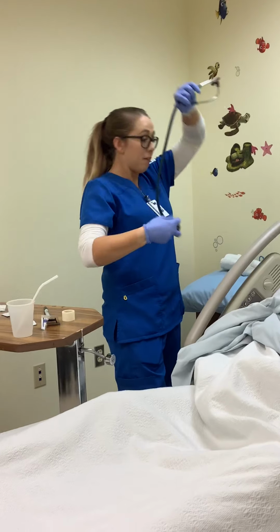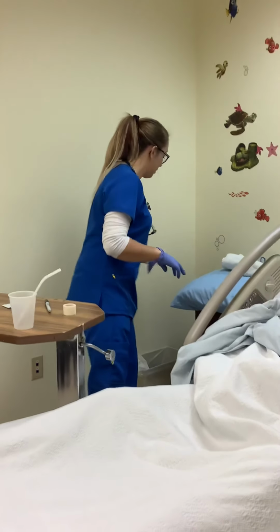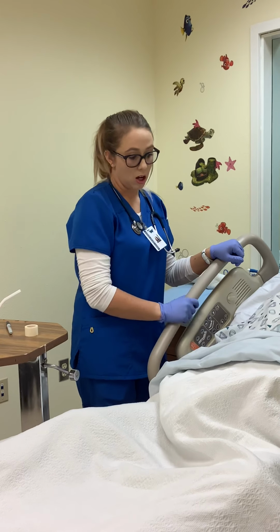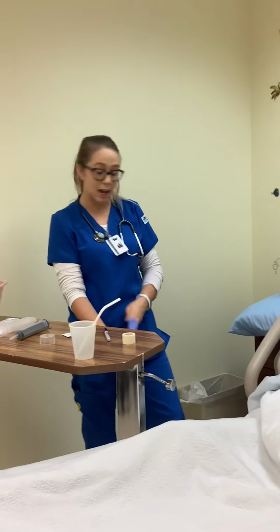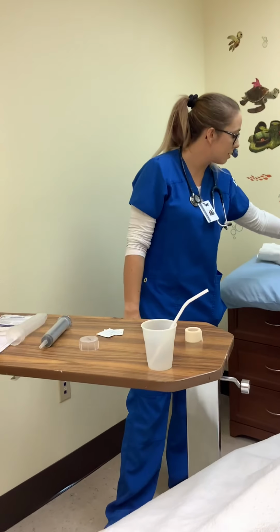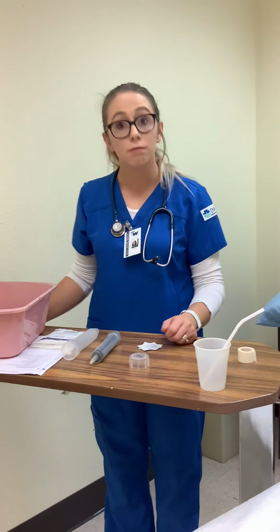All right, so we got your mouth all cleaned up. You got a glass of water. Do you need to use the restroom or any help with that? No? Okay, just kind of want to sit here and relax from that little trauma you had there. And then I make sure she had her call light on. Then I would leave the patient's room, taking off my gloves, performing hand hygiene, as well as documenting everything. You want to document kind of what was in the suction cup, like the drainage, color, how much it was. After that, I think we are all done. Thank you.